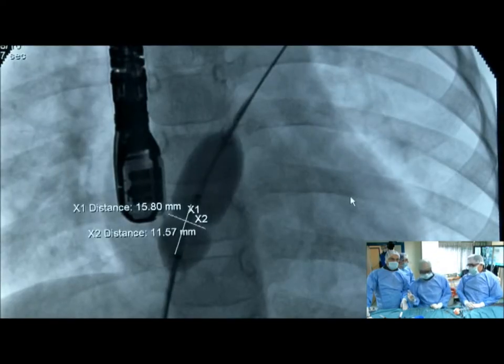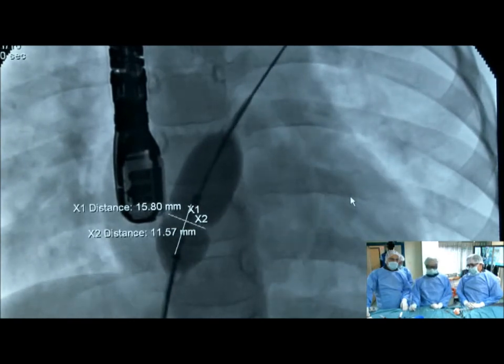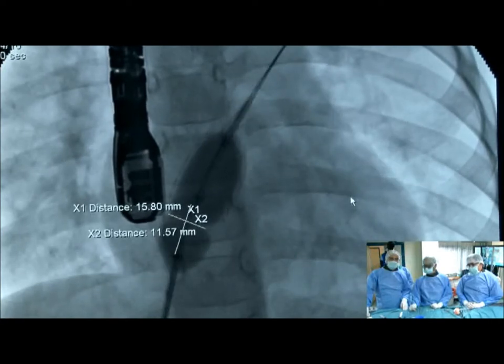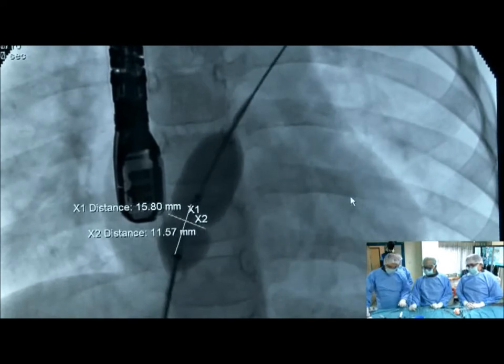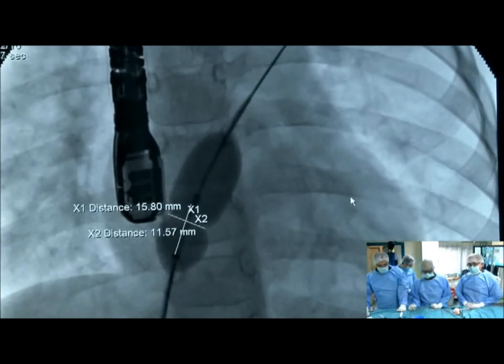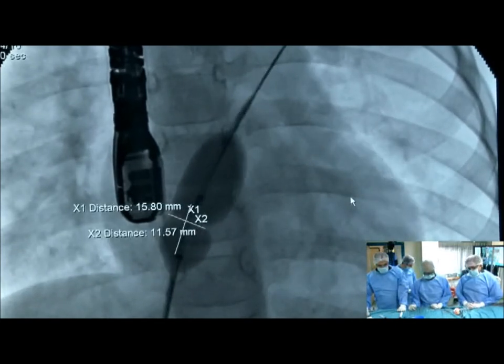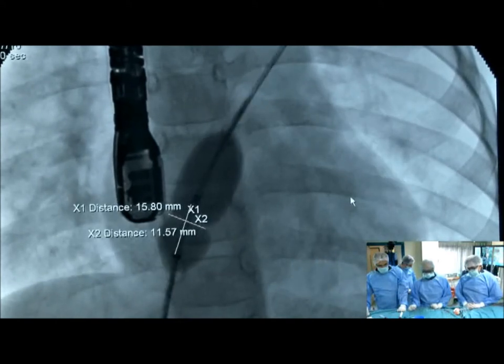When you have multi-perforated defects, the issue is whether you think there are multiple holes or just a big hole and small additional fenestration. I think you demonstrated enough that there is indeed a big hole with additional fenestration. If you close this hole with, for example, an 18, you measure 15, 16.